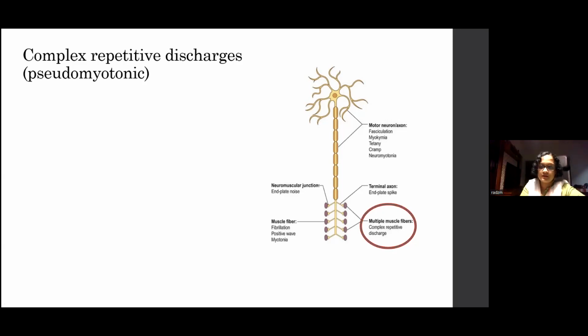So drrr. See that. They group muscle fibers, and they appear from multiple muscle fibers when muscle fibers are damaged either due to a neurogenic process or a myopathic process. They can be seen in both neurogenic and myopathic conditions. But one important thing is they're seen when it's chronic. So they're seen in chronic neurogenic processes and in chronic myopathic processes.